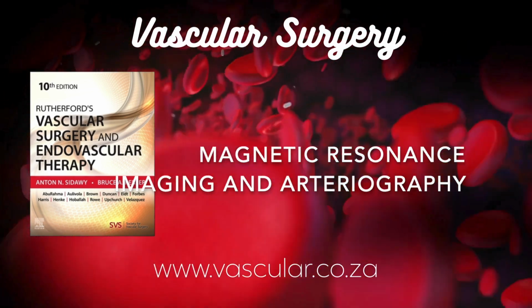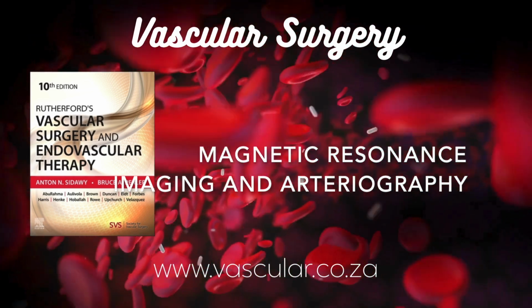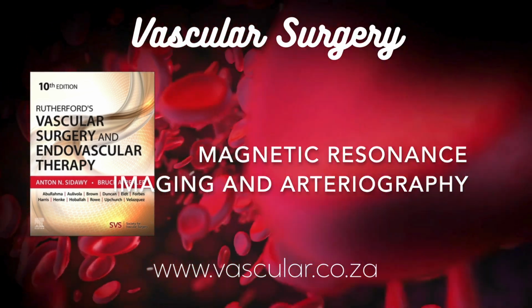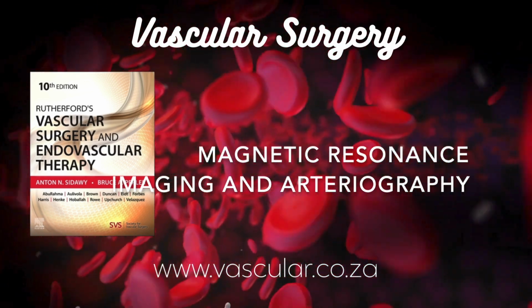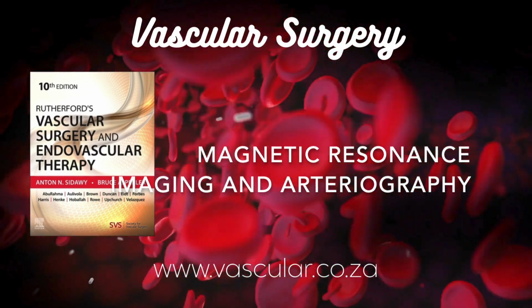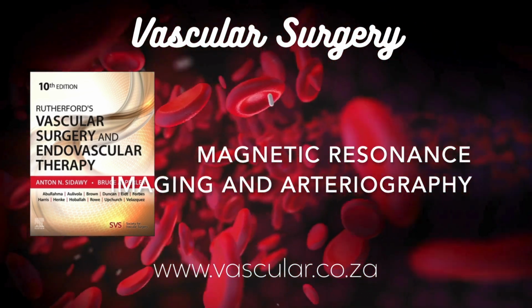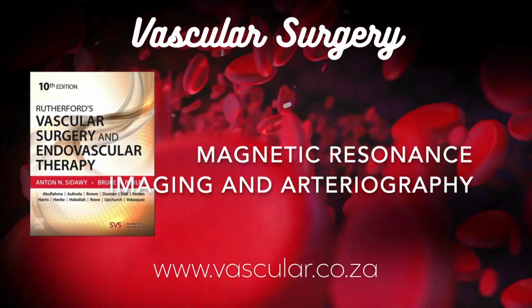It means even a very tiny amount of MR contrast can have a big effect, because its influence is amplified across many, many water molecules nearby. So you don't need as much contrast compared to other types of imaging. Generally, yes. That's one reason why the volume of MR contrast used in MRA is often significantly less than the volume of iodinated contrast you'd use for a CT angiogram or a traditional catheter angiogram.